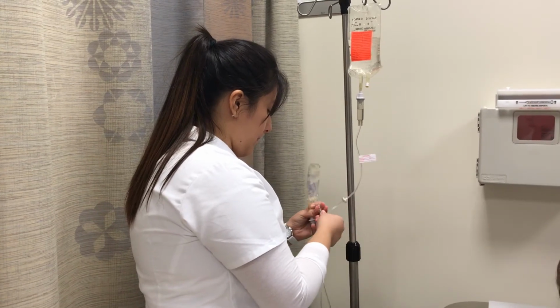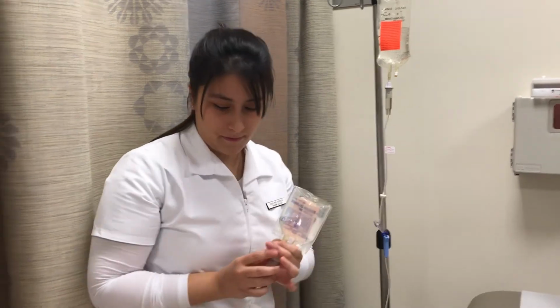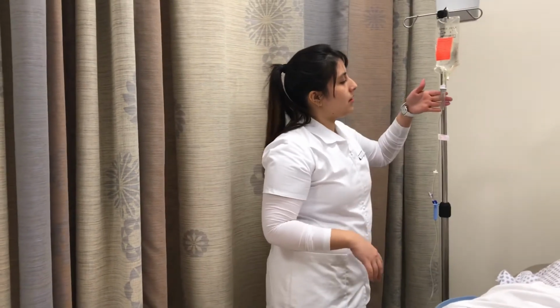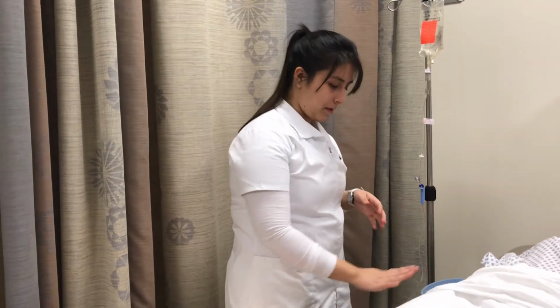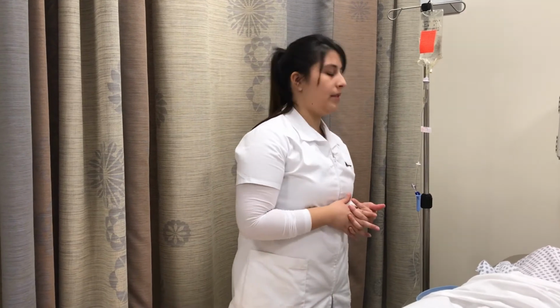Disconnecting. You always want to keep in mind too that once you put your gloves on, keep them above your waist. This would be empty, so I'd be disposing of it. And I would readjust the primary IV back at its original drop rate. Making sure, once again, just assessing for any redness, swelling, and the patency.